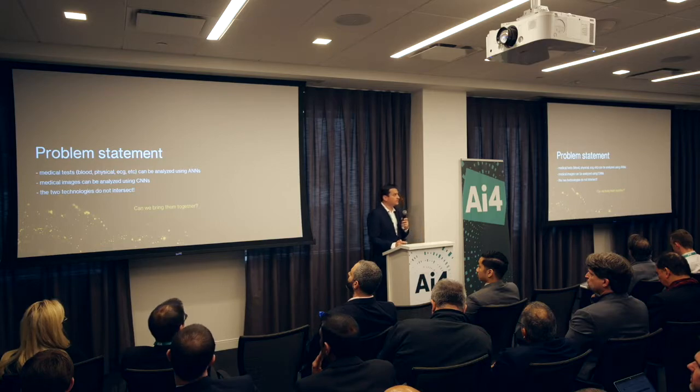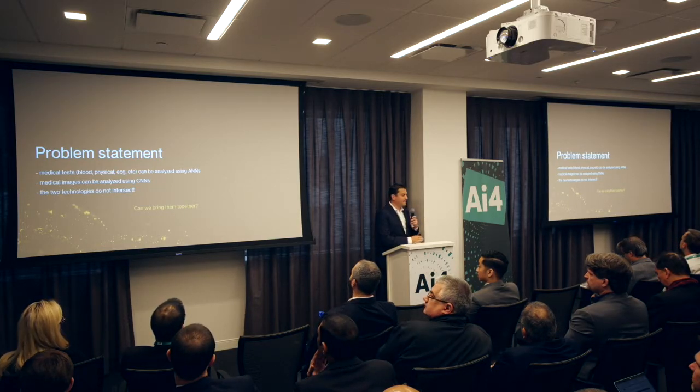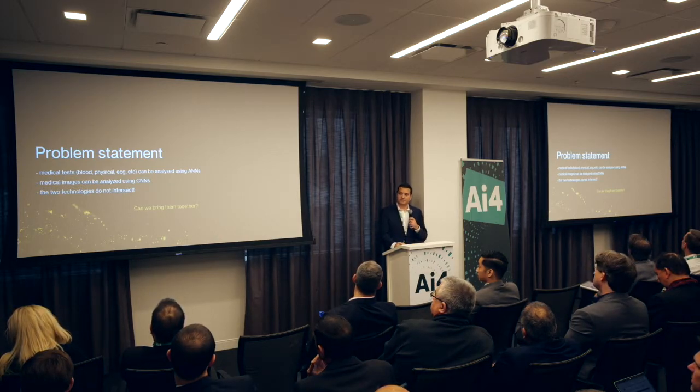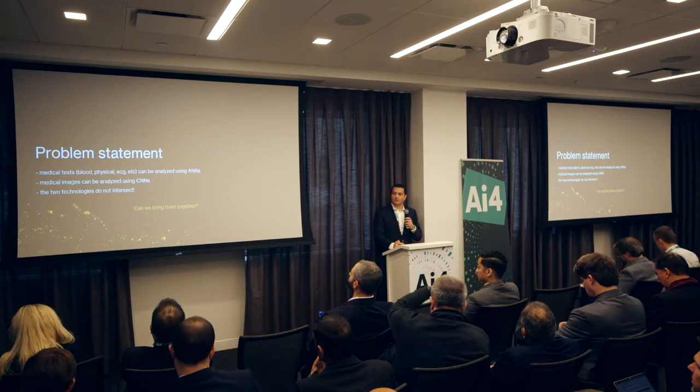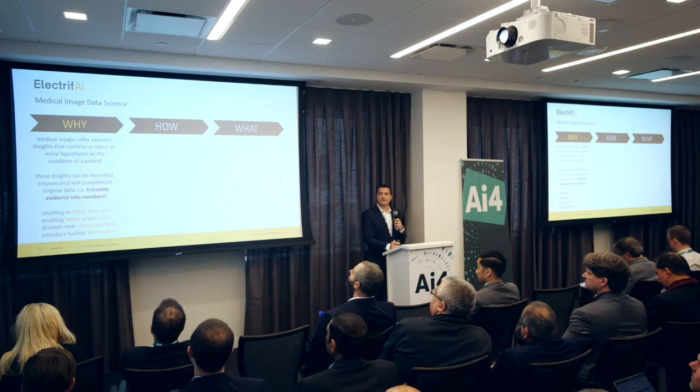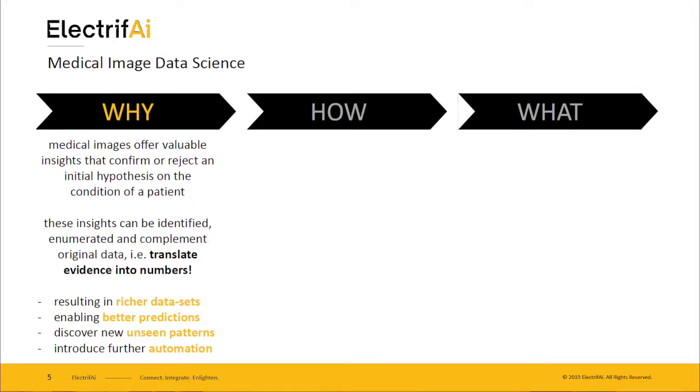But one thing that we do notice is that the two technologies do not intersect. So you've got numerical data handled in a separate manner from the optical data. So the question is, can we bring them together? And why do we want to do that? Simply because we do see that medical images offer valuable insights that indeed can confirm or reject the initial hypothesis. And these insights can be identified, enumerated, and complement the original data.